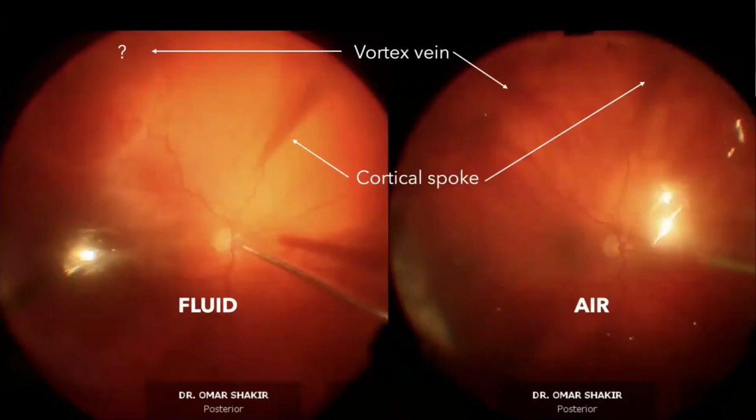And here's just an example of fluid versus air. So on the right is air, on the left is fluid. One of the ways you can tell here is on the left of the light pipe, which is on the far left of the image under fluid, is giving a shimmery view in the fluid. On the right, that light pipe is reflecting off of the air meniscus at the bottom of the eye, giving a reflex of the light in a different place. So that's one key detail that when you look at the image, you can tell that there's got to be air in this eye.